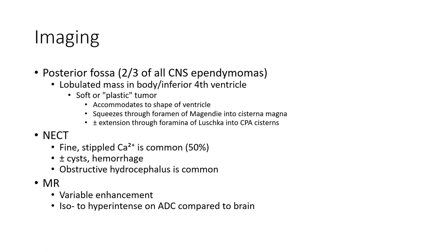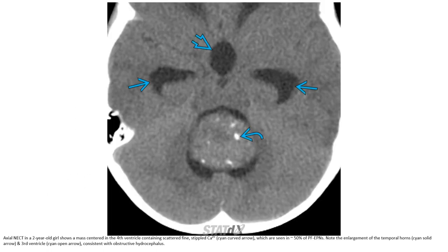Variable enhancement. This is a non-contrast enhanced CT in a two-year-old child. The mass is centered in the fourth ventricle containing scattered fine stippled calcification, which is seen in 50% of posterior fossa ependymomas. Note the enlargement of the temporal horn and third ventricle, consistent with obstructive hydrocephalus.